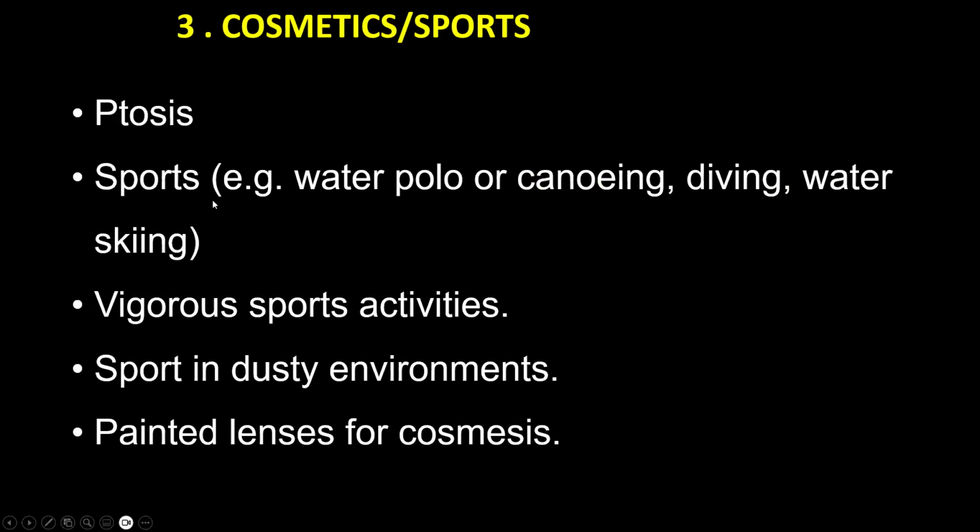So for sports, why do you think it'd be useful? Because it is suitable, it is stable, it can give the quality of vision you want, and it can last for a long time. You can be comfortable for a long time. So people who do sports can wear it because it won't easily fall off like the RGP. Vigorous sports activities, again, of course, is useful because you can trust that the lenses won't fall off. For sports in a dusty environment, that is very useful because you can be sure that before the cornea would get affected, the person would have come back to maybe clean the lens at the end of the day.